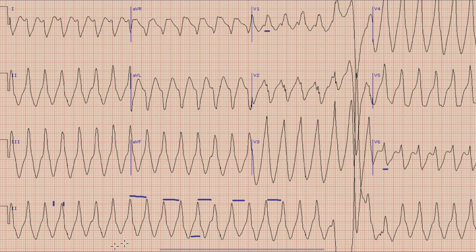The next step is to look for the presence of AV dissociation. When we look at the rhythm strip, we cannot see a definite P wave in the leads, so we cannot comment on AV dissociation in this case. Similarly, we cannot find any capture beats or fusion beats on this ECG.